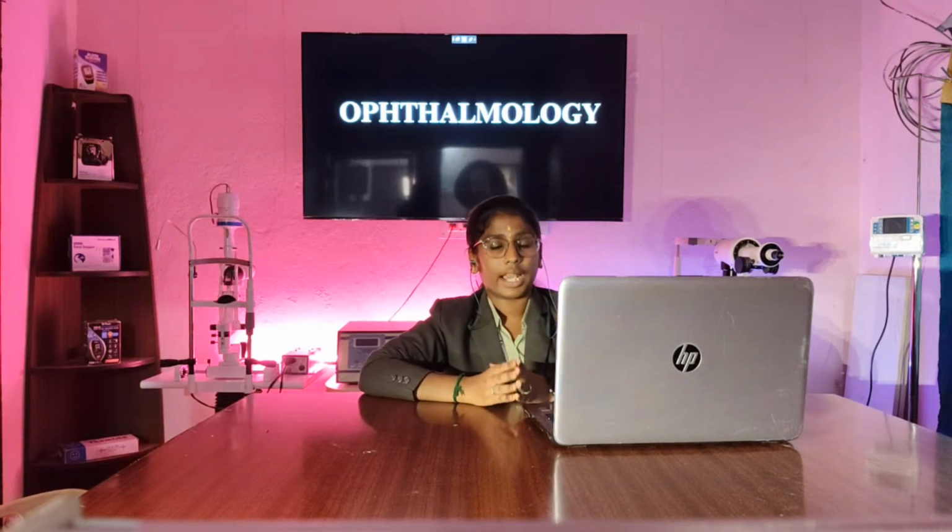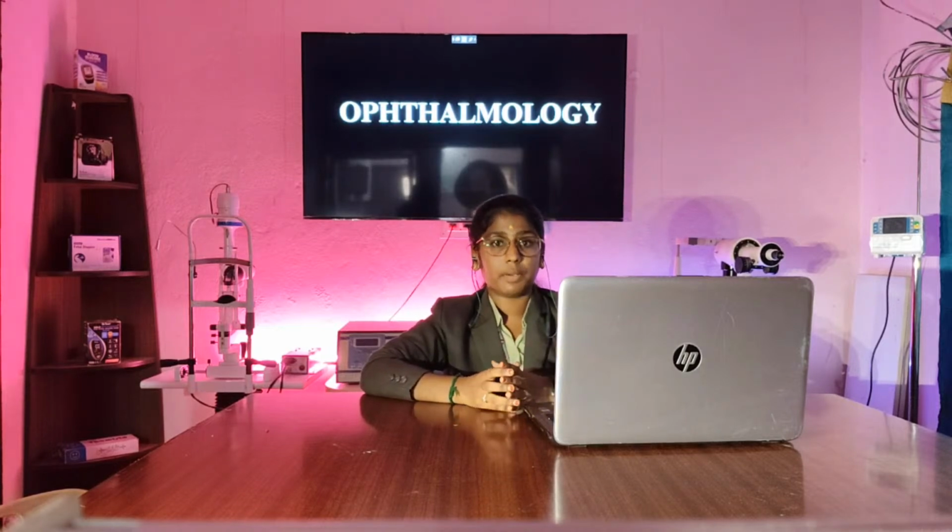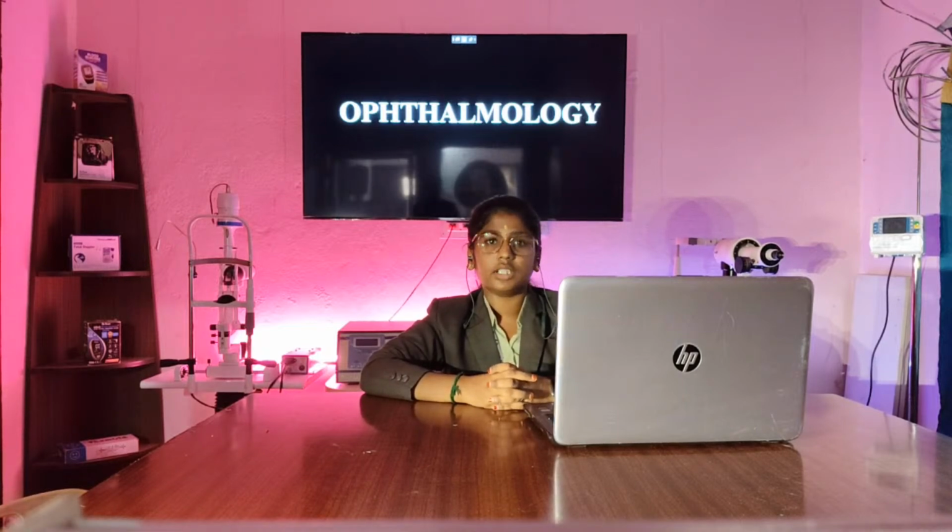For diagnosing the disease, there is a patient and there is an output to be set. What are the problems there? What are the results we are getting from that? It is done by the doctor or clinicians. So between the doctor and the patient, we have an interface called equipment. It is calibrated, troubleshot and maintained by the biomedical engineer, and it is used to see the vital signals inside the eye. Commonly ERG and EOG are used for detecting the signals present in the eye.